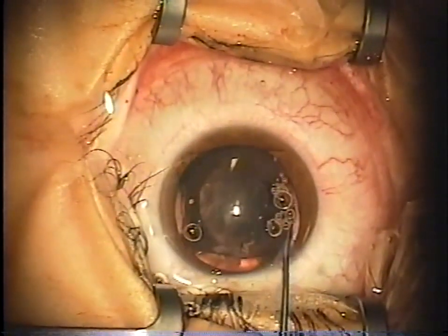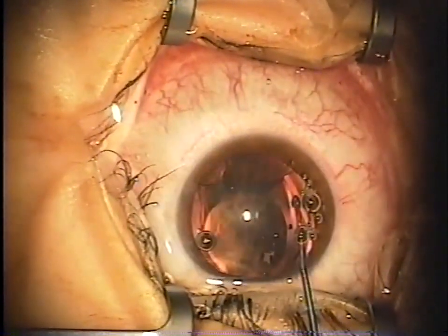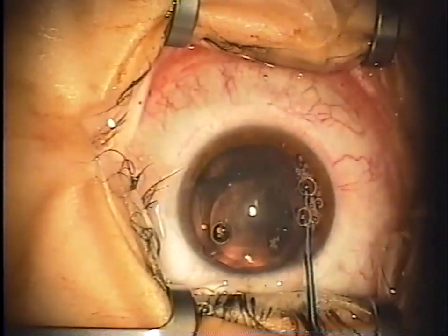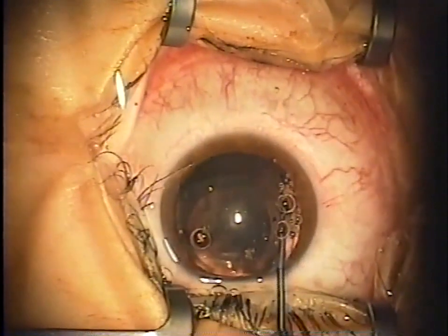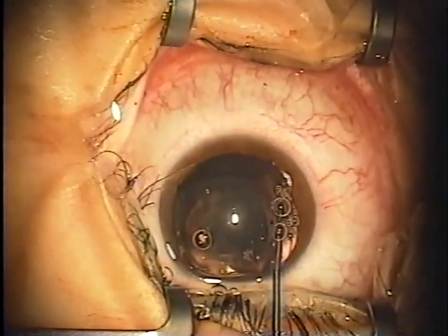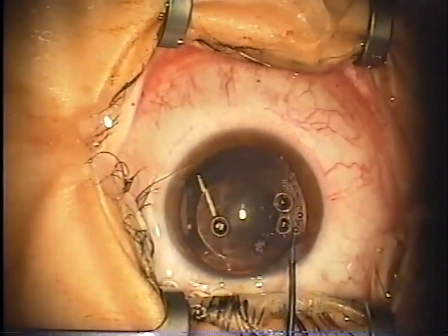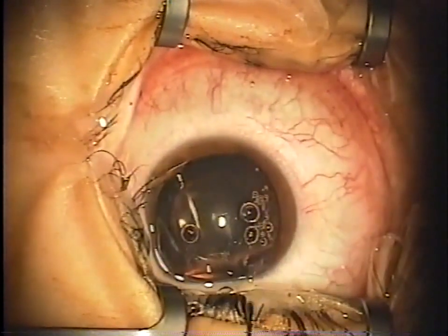Next, this is an IOL manipulator specifically for the ICL. You want to take and tuck the haptics underneath the iris. The eye is still filled with viscoelastics, so it can be sometimes a couple of tries to get the haptic underneath the iris edge. This motion is a more horizontal back and forth movement, not an anterior posterior pushing. You definitely don't want to push down on the lens, as that can cause local cataract formation.